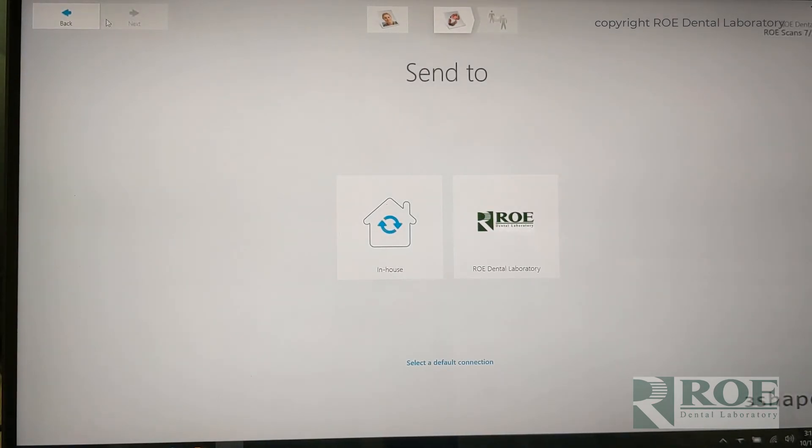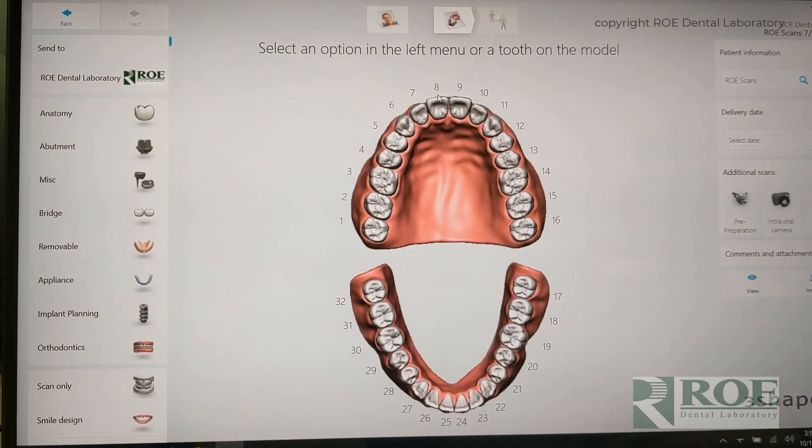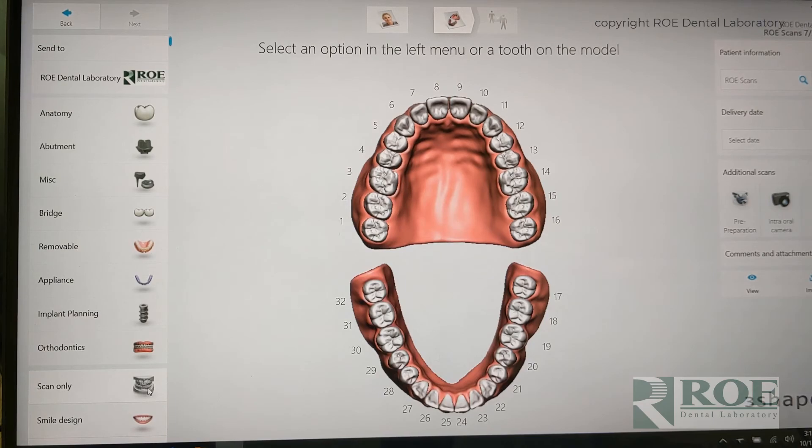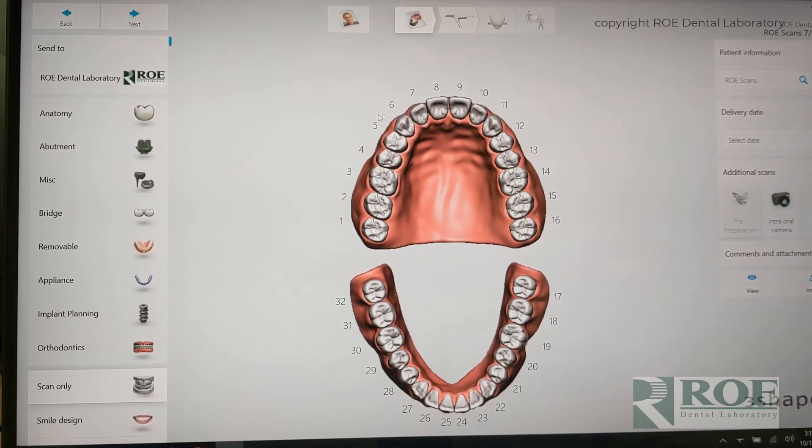When we set up a case for dentures, we pick the case here and we always choose scan only for most of our scans — implants, dentures, that type of thing — because we really just want to acquire the surface. We don't want to tell the software that it's a denture, partial, orthodontics, or implant restoration. You really just want to scan the surface. So I'm going to pick scan only, then go to the scan page and scan the upper first.